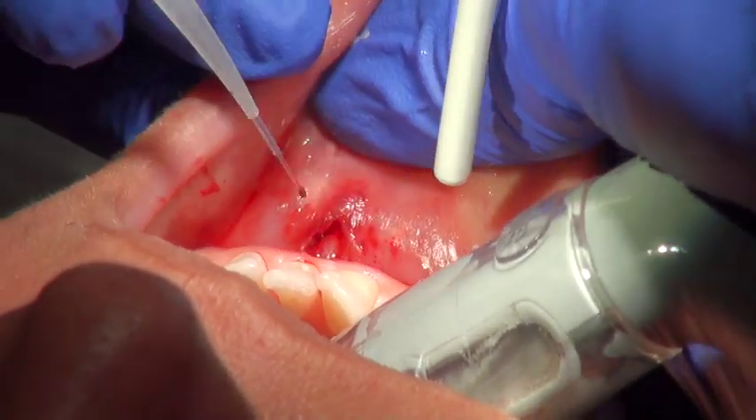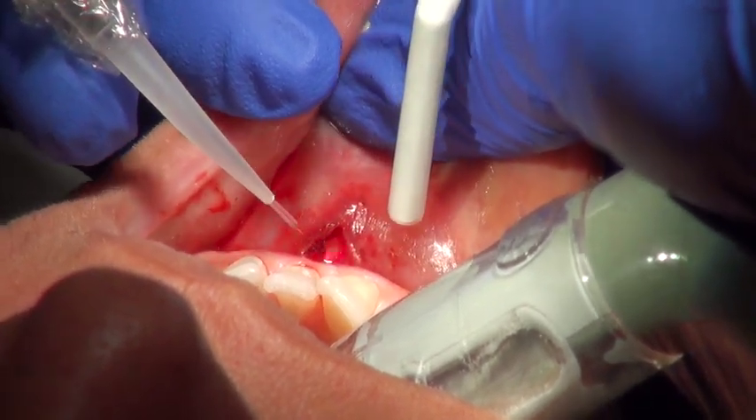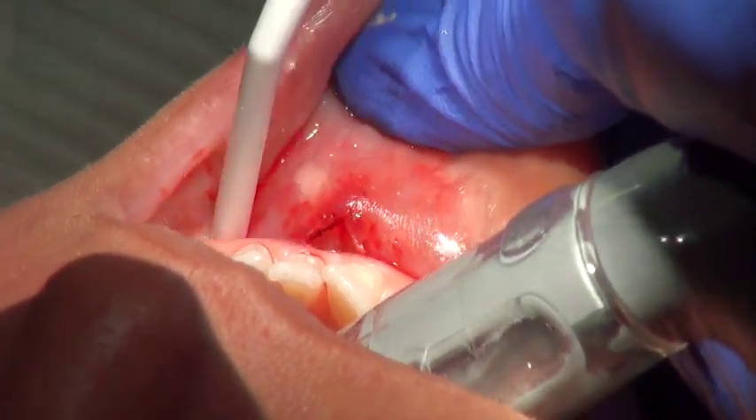Do you think? Now, suturing would make sure that it couldn't go back, right? That's why I don't want a suture using a laser. Where's the bleeding? There's none. I mean, just to avoid it growing back.